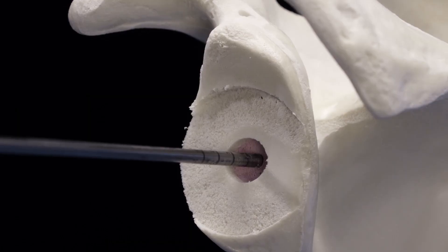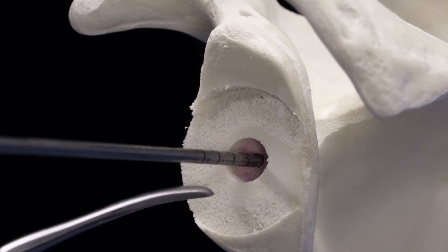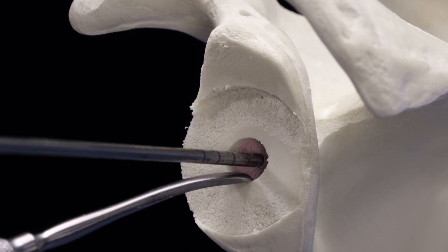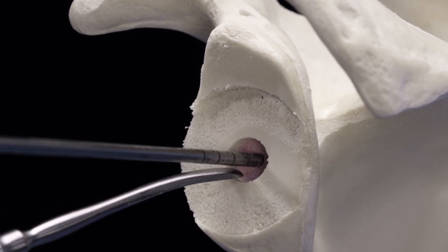We have now completed our secondary VIP augmented MGS reaming. You'll notice a key difference from the standard MGS compared to the augmented MGS: you'll still see some depth from the pilot ream. This is because of the nose sticking off of the augmented VIP MGS secondary reamer. This will be eliminated when you ream for your central post.